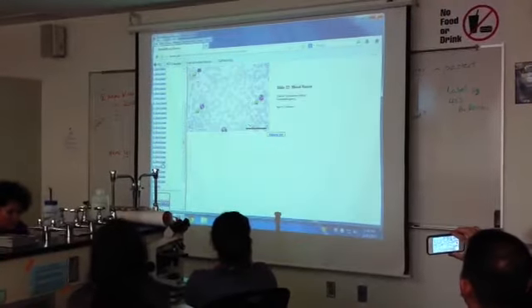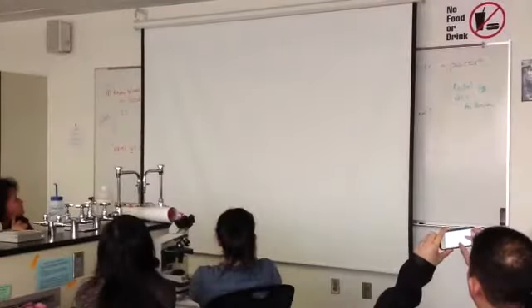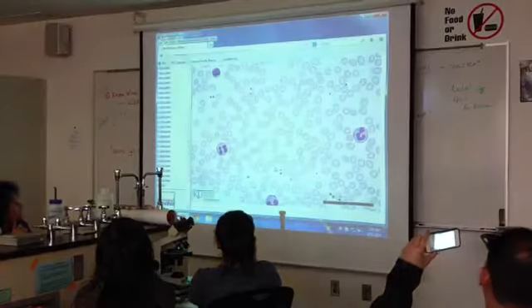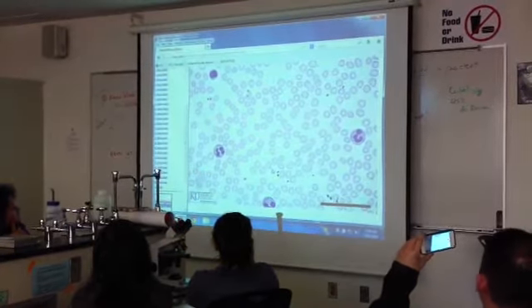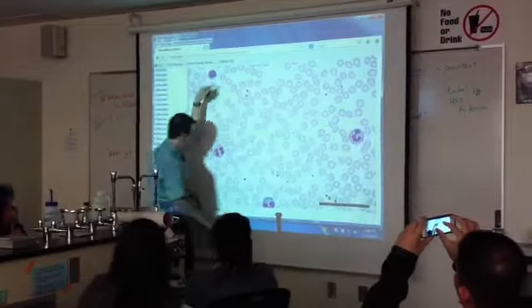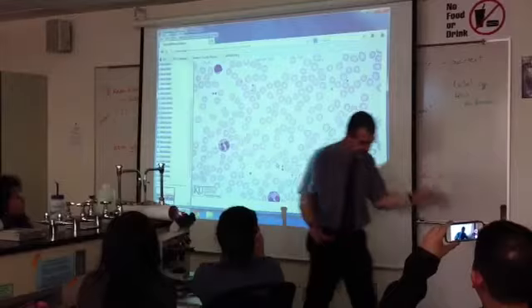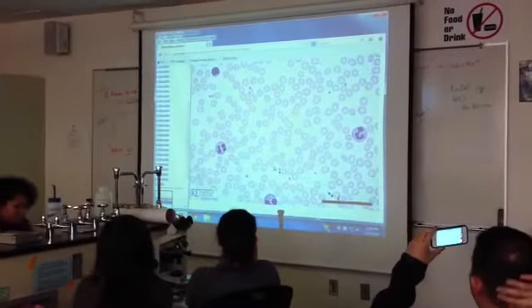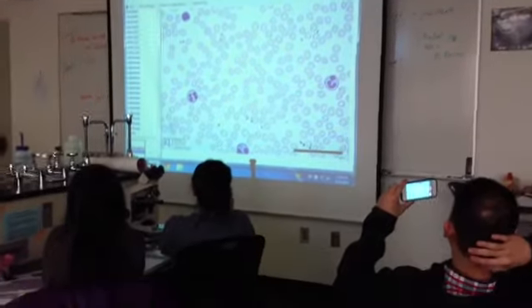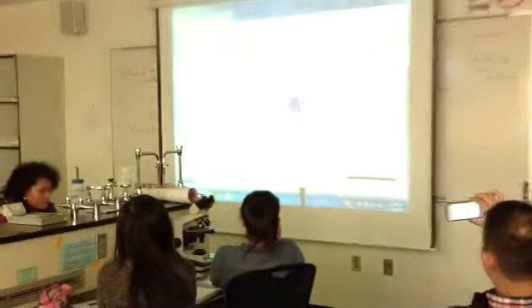Let's keep going. Name the white blood cells you see there. Start up there. Lymphocyte again. Neutrophil. Neutrophil. Okay, that's on an exam. Just say neutrophil, lymphocyte. All right. This one is not a neutrophil or a lymphocyte.